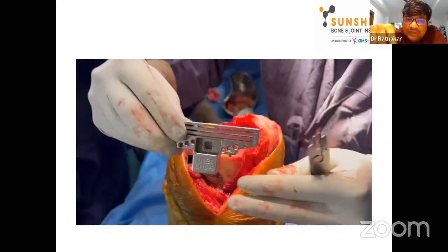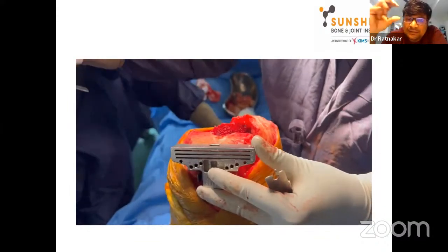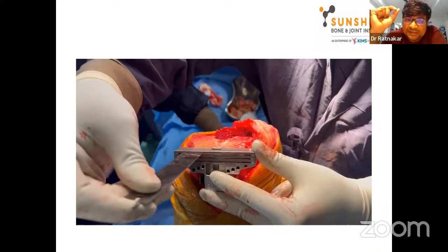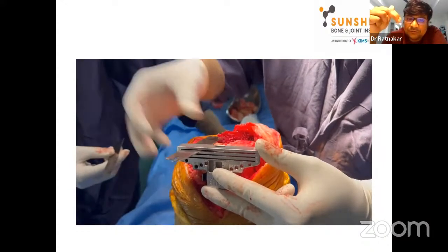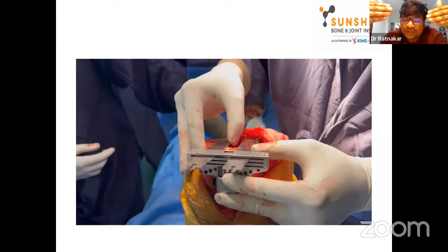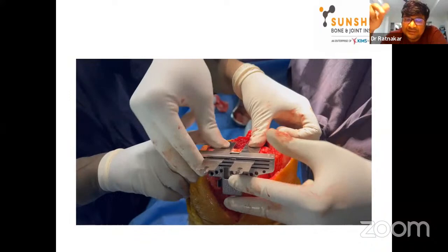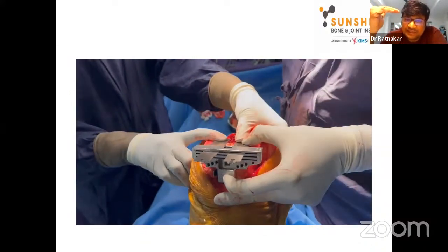But it's not always possible to identify the pin sites. So what I'm doing here is, this is a distal femur resection block. I just placed it on the anterior aspect of the femur shaft. Then I'm taking two blades. These two blades, I will pass through the resection slot, which I used initially to cut my distal femur, and flush it into the distal femur cut area. You ask your assistant to stabilize both blades, and anteriorly you stabilize this distal femur cutting jig.